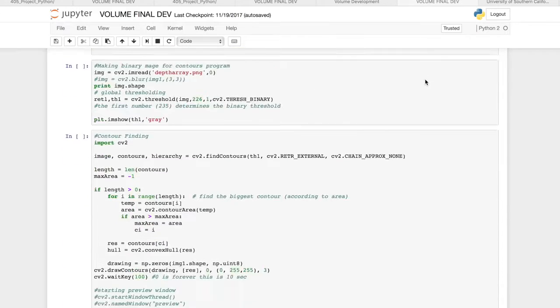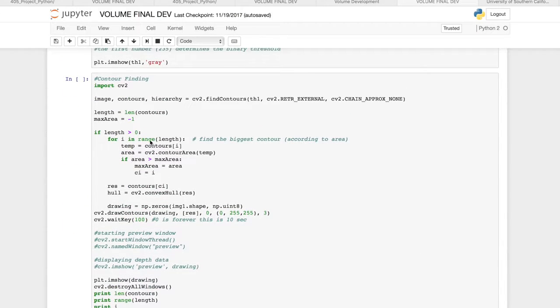Farther down, you can actually see here, a little farther, is the contour finding. And what it does, it just takes the averages of values as you go across the image, and then if there's a large spike, it creates a contour pixel and then plots an actual contour.